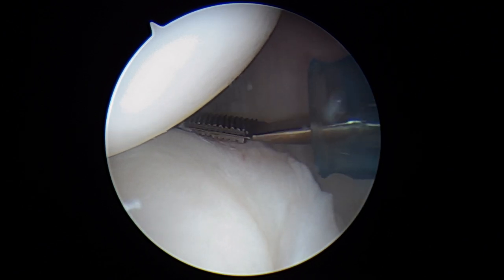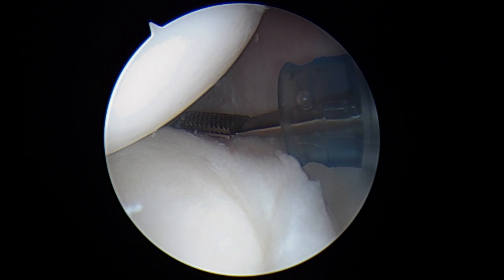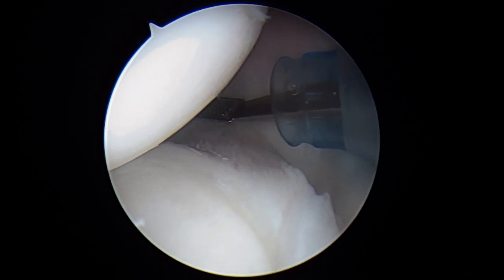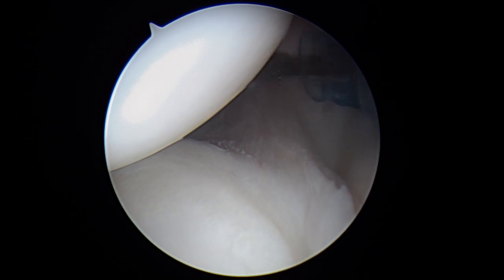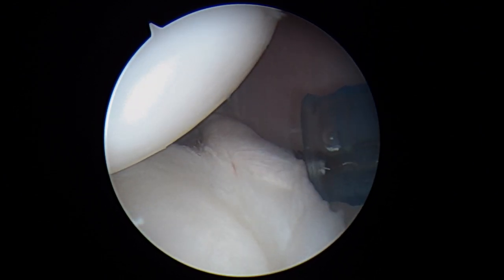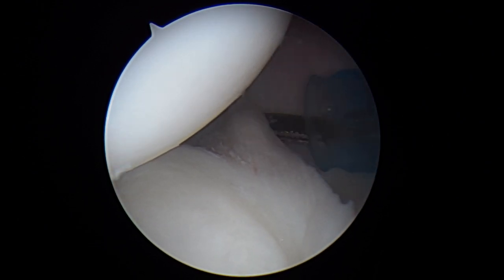We're going to use a suture anchor called the Ynot Suture Anchor — the 1.3 millimeter Ynot Suture Anchor. It's a single loaded suture anchor that we're going to place percutaneously into the glenoid right about here. That's going to help us tighten up this posterior band of the inferior glenohumeral ligament. With this rasp, we're just trying to create a little bit of an insult to create a healing response.